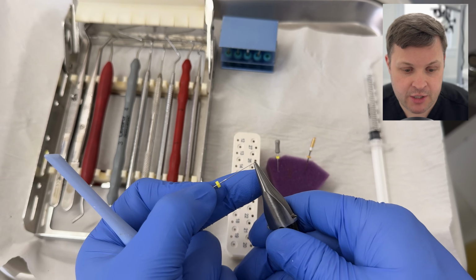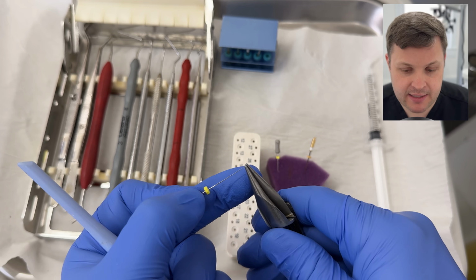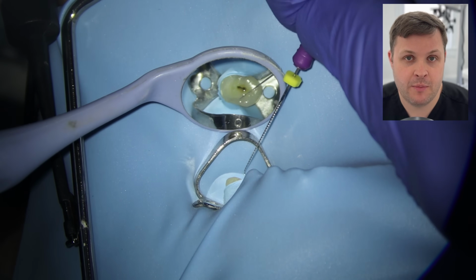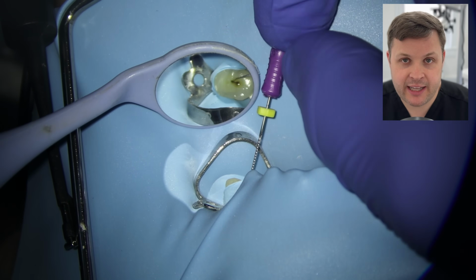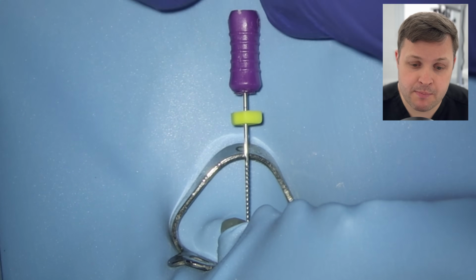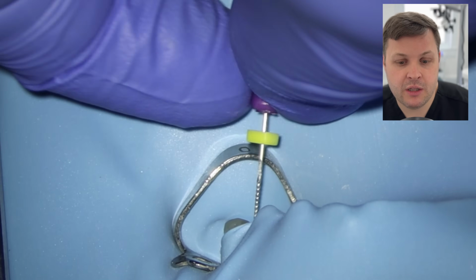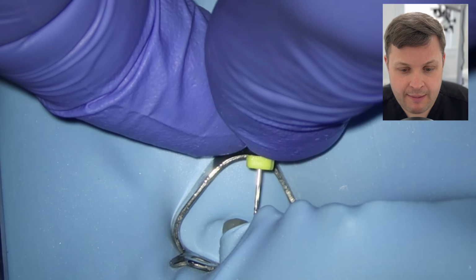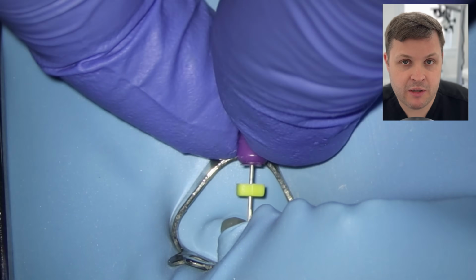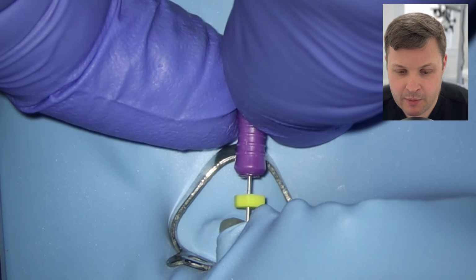Work out that you have a ledge, and to get past this, we're going to make a little bend at the end. Now, this ledge has unlikely been caused by me. It's probably just an anatomical anomaly. It might be just a catch or whatever. But the principle is the same as with the ledge. I'm going to make a small bend at the end with this little size 10 K-file, and slowly move the hand file around in a 360 degree motion, trying to feel for the point where we can get the hand file past, and we can see that we've got it past here.